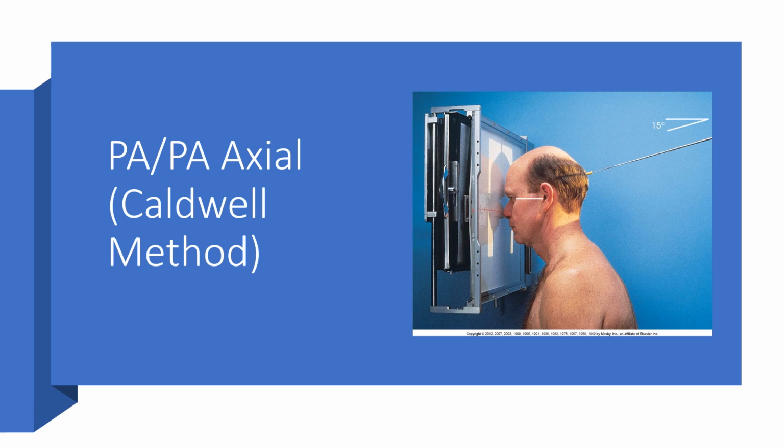Now, this looks like it's centered a little low. Well, it's out of detent is what it actually is. Well, no, because the cassette is riding high. It's not centered to the glass plate. So it's not out of detent. It's just I've never seen a unit like this where you have an off-centered cassette.